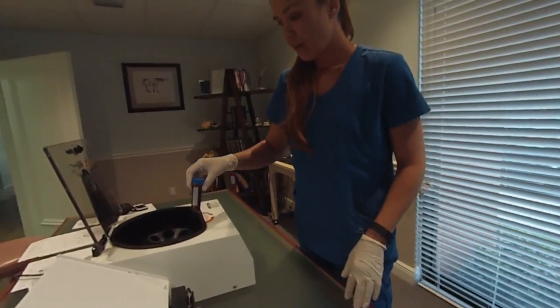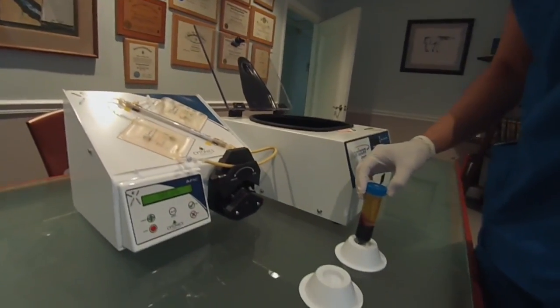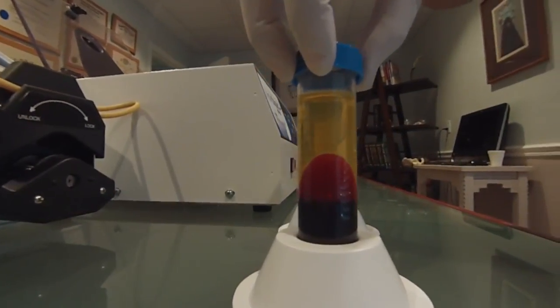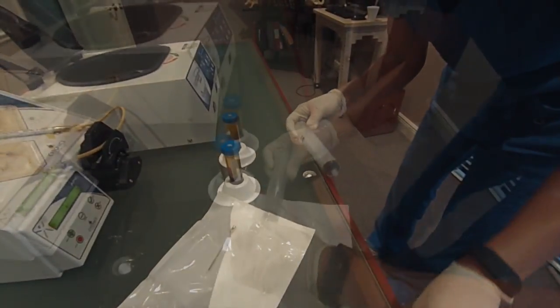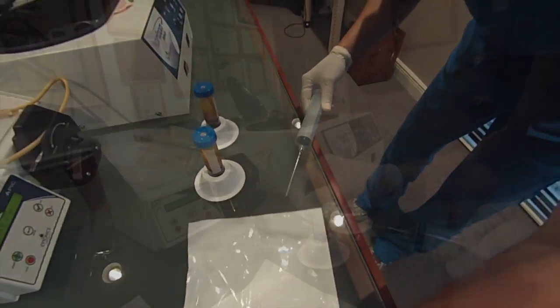Carefully load the tubes into the centrifuge. Close the lid and lock. When the cycle is complete, remove the tubes and place in the rack so the wall of red cells is facing away from you. Remove the metal plasma collection needle from the sterile packaging and connect to the 60mL syringe provided in kit number two.